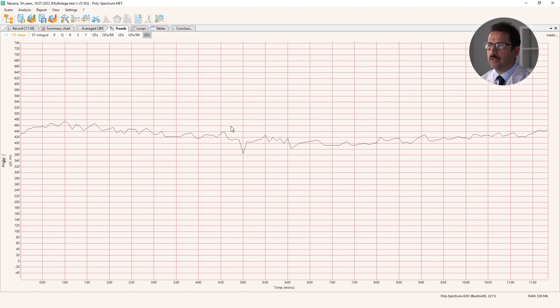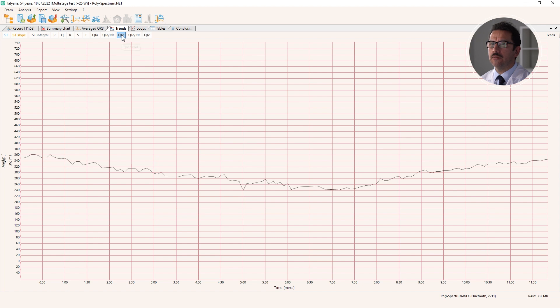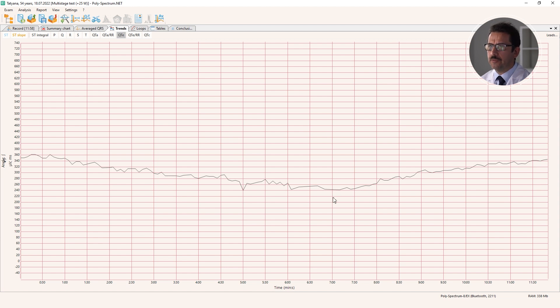We can see QT dynamics different from normal — for example if QT is shortened too much during the test or not shortened properly. Looking at natural QT without correction, we see that during the test when heart rate is increasing, QT is shortening, and during recovery it elongates back. That's normal QT dynamics.